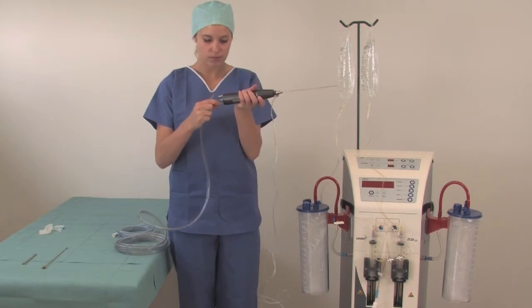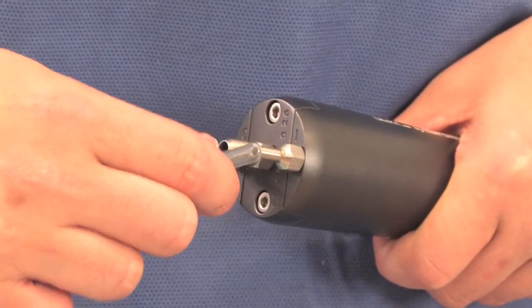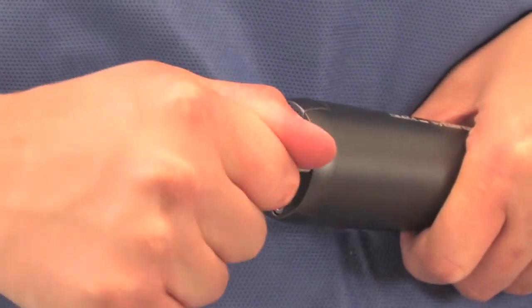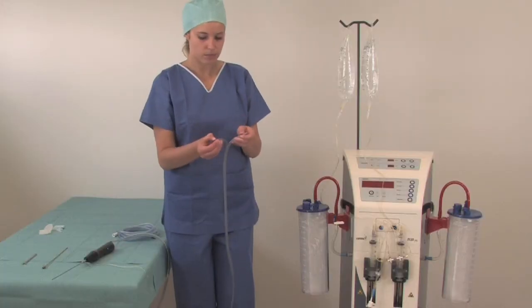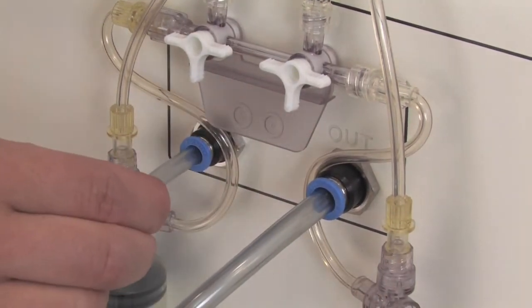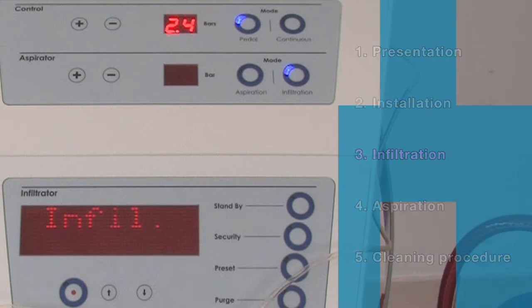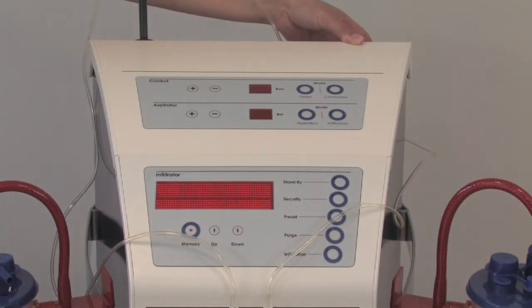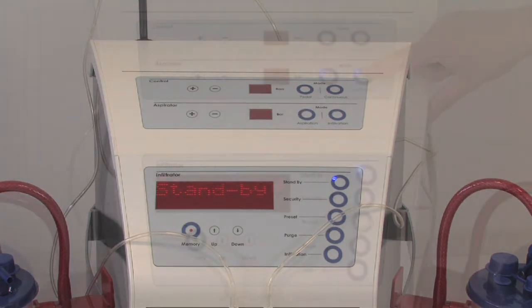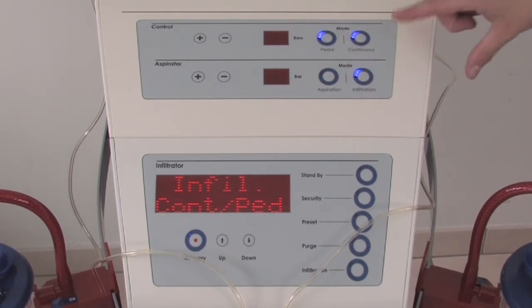Connect the air tubing securely to the in and out Lipomatic connectors. Connect securely the other end of the air tubing to EVA SP6 in and out connectors. Switch on the EVA SP6. Select the infiltration mode. Select pedal or continuous mode.